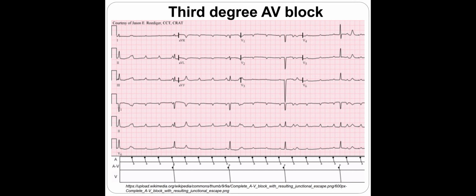How do we figure out that this patient has a third degree AV block or only a 2-to-1 AV block? Anybody has any kind of suggestion? Did you understand what I said? Maybe if we can find the negative P after QRS in case of third degree AV block, that confirms it. Yeah, it could be, because sometimes the ventricle escape beat goes backward. But if you do have a block, there's no way that it can go back.